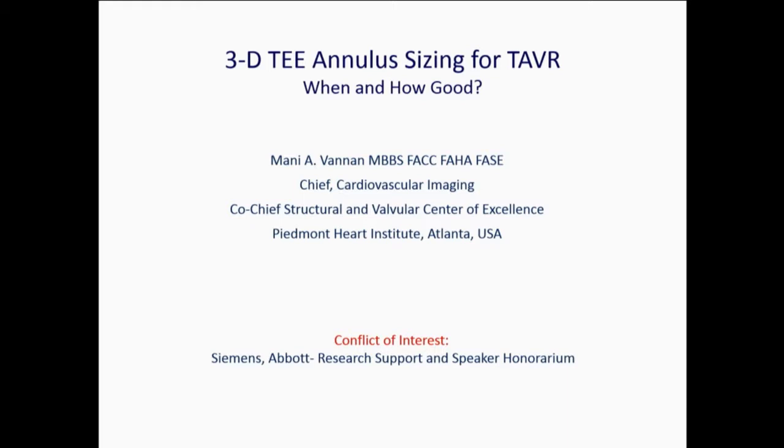I think. So as an opener, I would state that CT remains and should be the first technique of choice for sizing the annulus for TAVR. But I do have a take on where 3D TEE might fit.